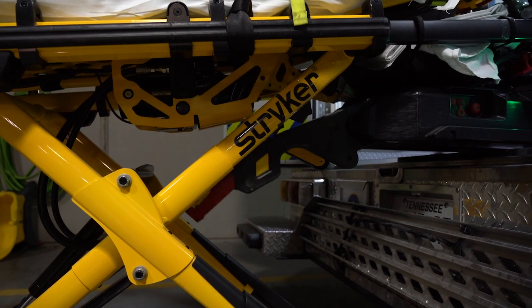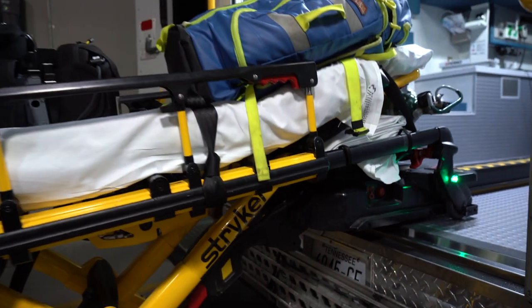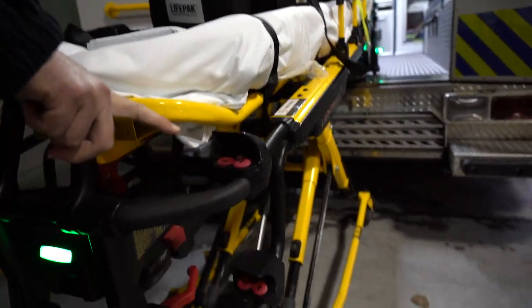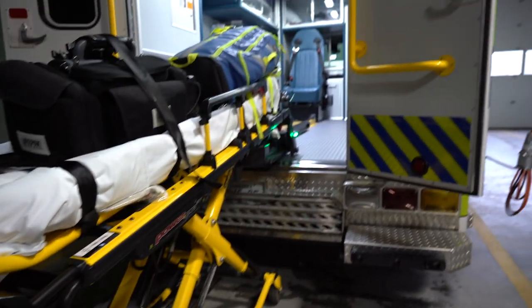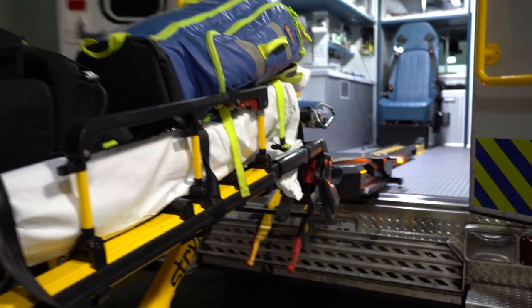These levers have to be completely clear in order for it to come loose. Then you can push the small red button and it releases it, and you can see the lights will start flashing. And then you're able to release your stretcher.